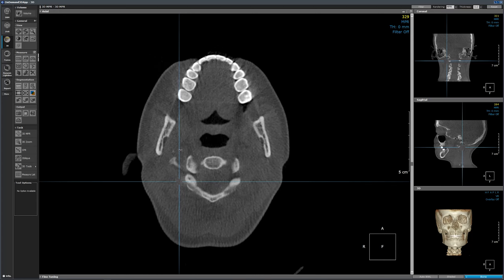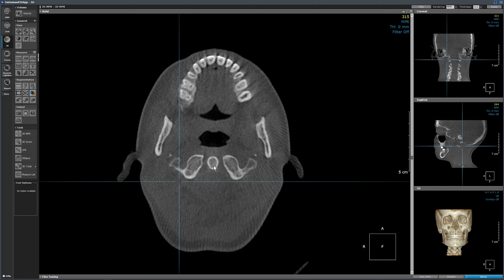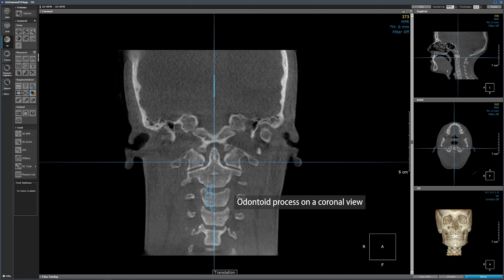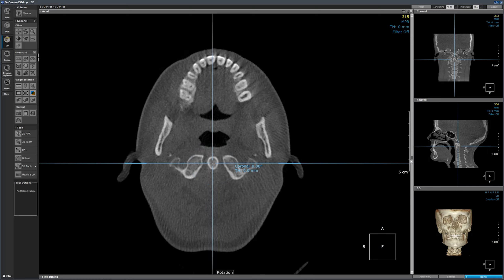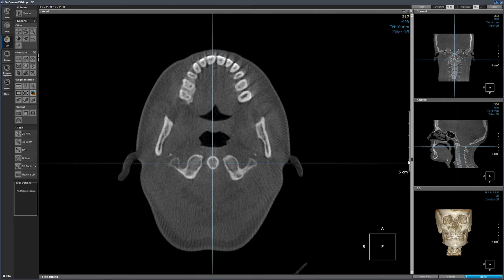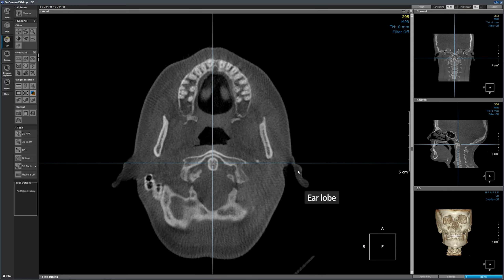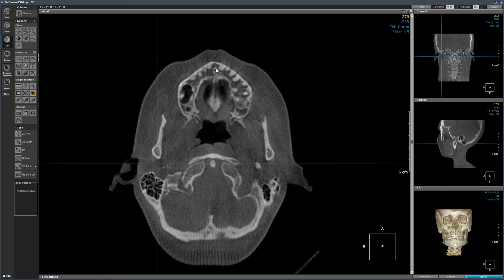This is the area of the lingula. We are picking up part of the tongue. This is the odontoid process — we had seen it earlier on a coronal slice. Moving through the anatomy, another bone we see is the styloid process. We have picked up the ear lobe, and we are picking up the maxillary arch. On the maxillary arch at the midline, we can see the nasopalatine canal.